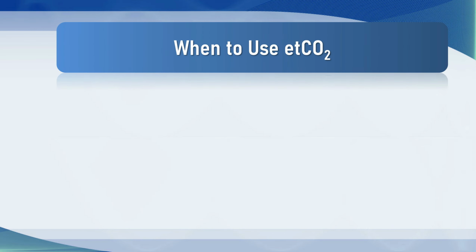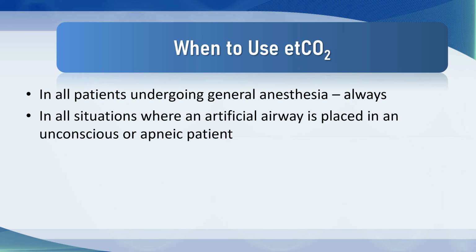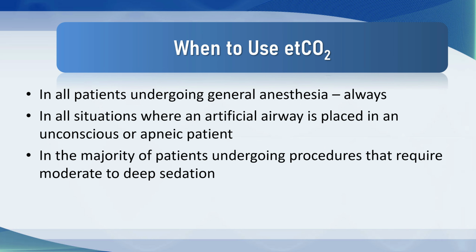So let's just wrap this up. When should we be using end-tidal CO2? Well, in all patients undergoing general anesthesia, always. In all situations where an artificial airway is placed in an unconscious or apneic patient. In the majority of patients undergoing procedures that require moderate to deep sedation.